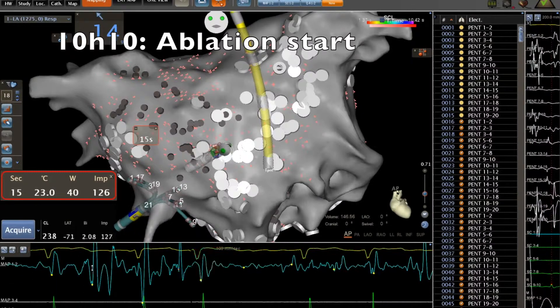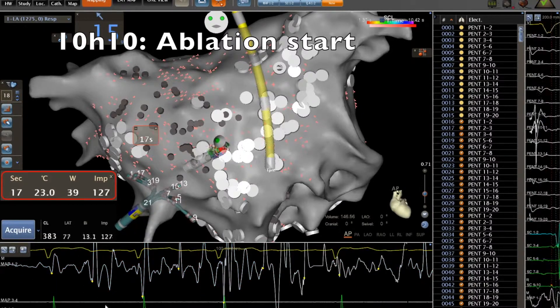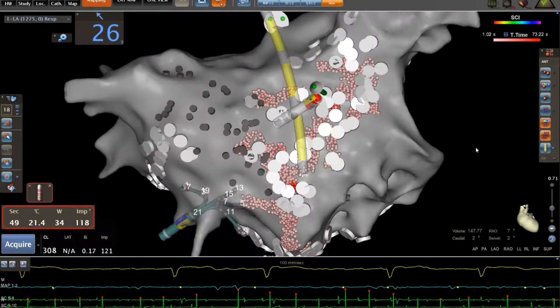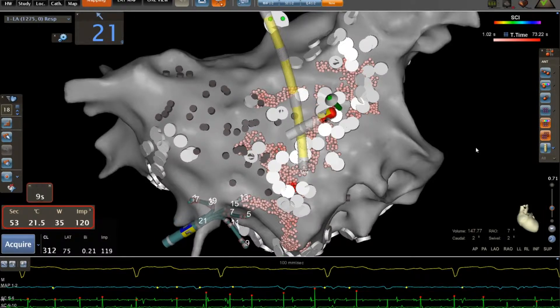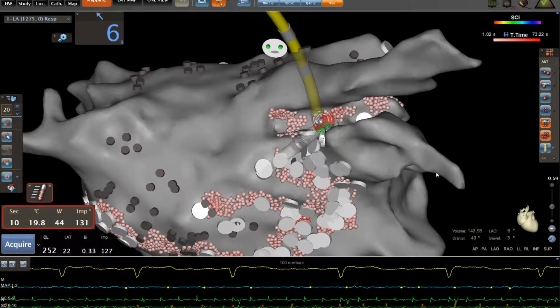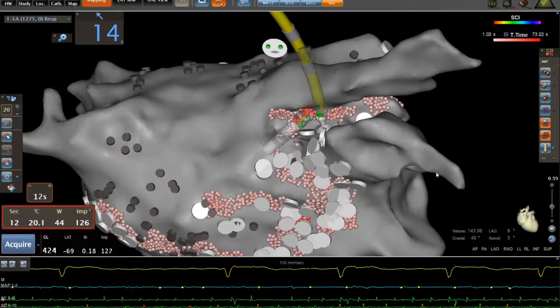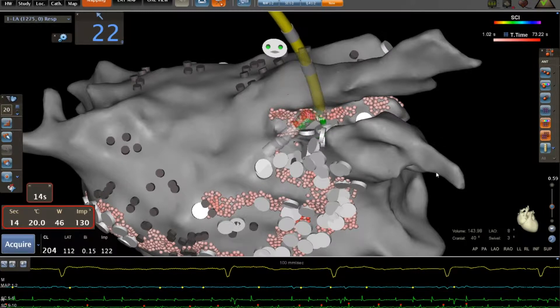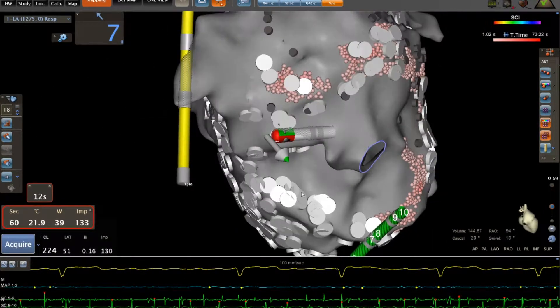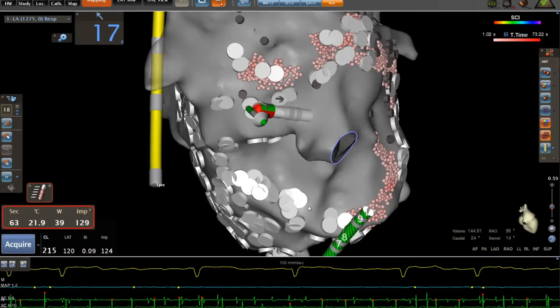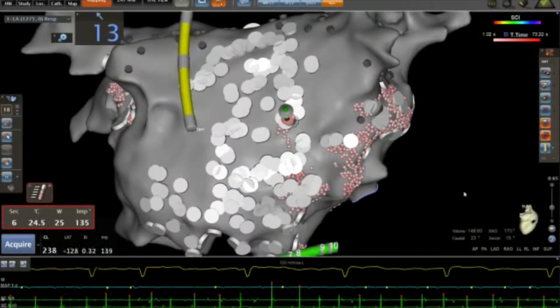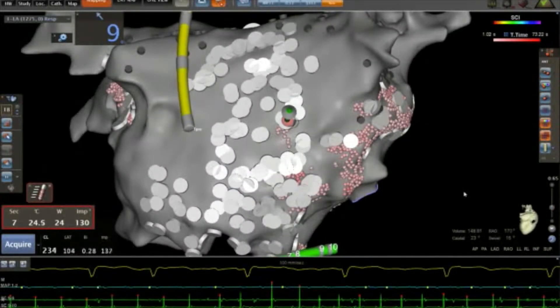We start the ablation of the dispersion areas in the left atrium. We use 35 to 45 watts on the septum and the entire wall of the left atrium. Our endpoint is to create electrical scar on this area of dispersion. We reduce the power on the posterior wall because of the esophagus position.